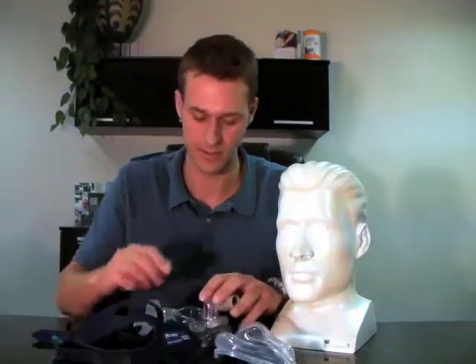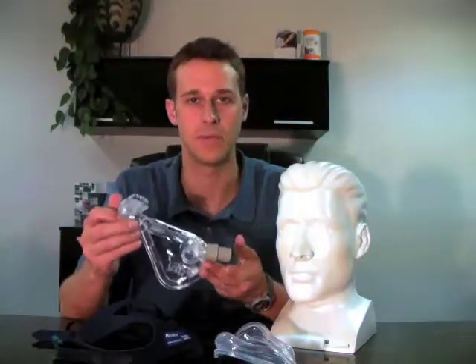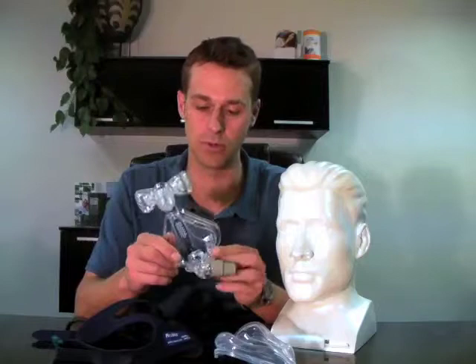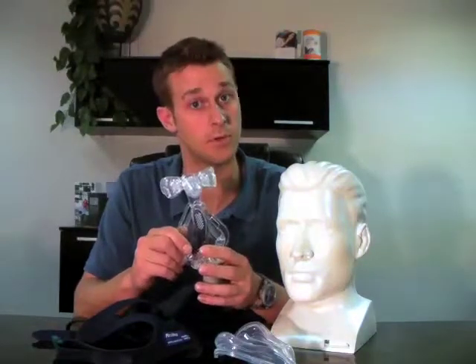The third piece of the mask is the mask frame itself, and this is made of a little bit harder plastic and is much more durable, although it's also replaced a couple times per year.